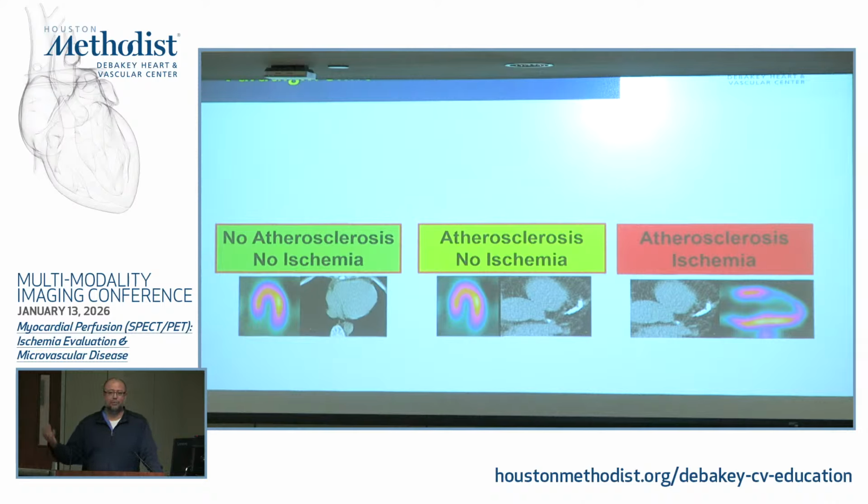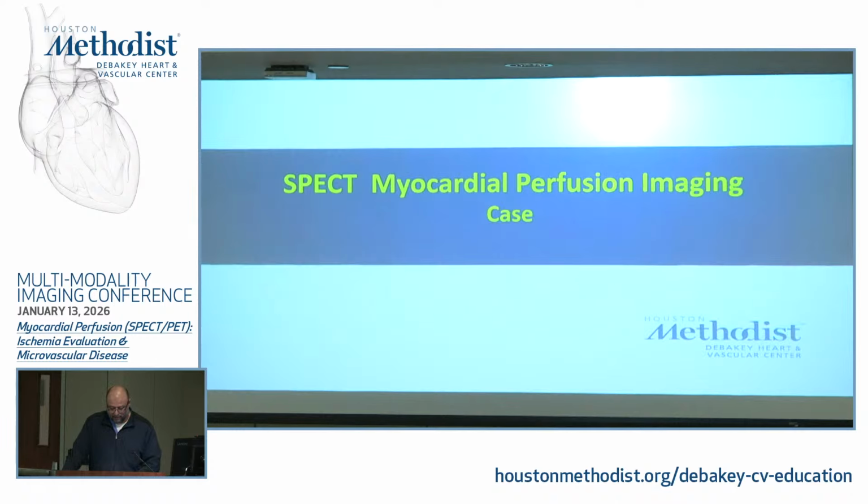So if you see a normal perfusion but the calcium score is very high and the patient has a good story, then you're going to go ahead and look for these. So let's do more cases.